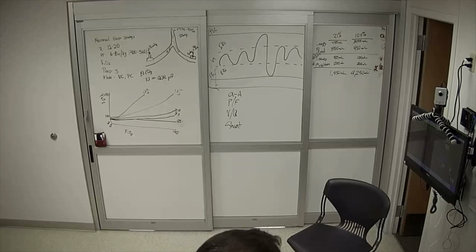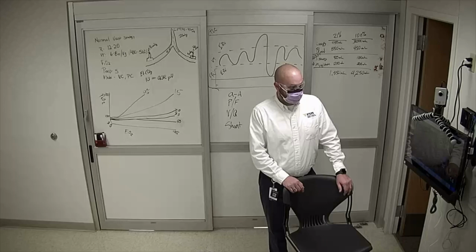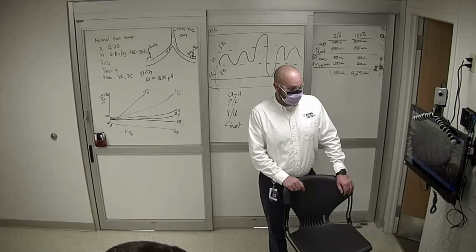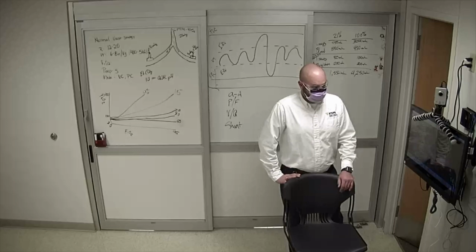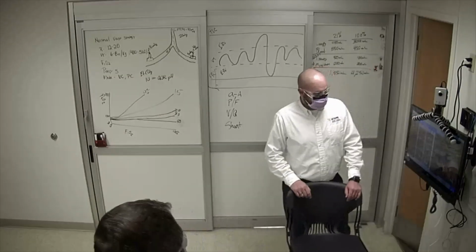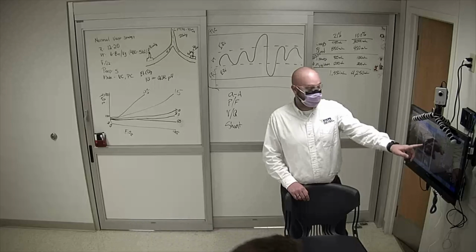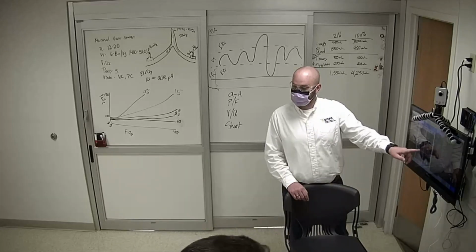Okay, so we've got a catastrophe happening. Tell me what you see. Oh, peak pressures. What's going on? Something's changing with Stanley pretty rapidly. As she said, peak pressure changed, which means compliance has changed. CVP increased. Wait a minute. So I've got a mismatch now. Got a gradient now. What happened?